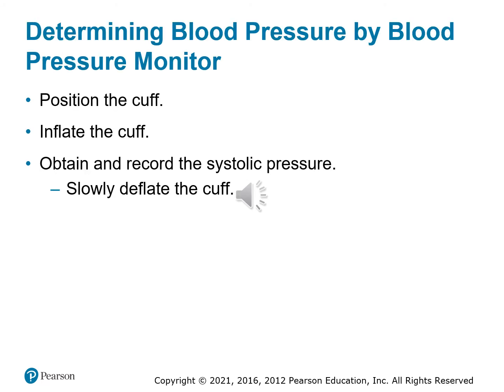And then just a quick slide here. If you're using a blood pressure monitor, position the cuff. Usually there's going to be a button that you push. On our cardiac monitors, it's called NIBP. You push that button, and then it's going to measure everything on its own.